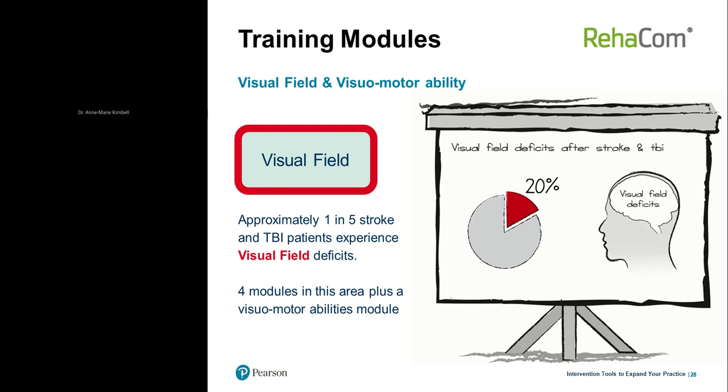There's a substantial amount of evidence that patients can be supported to compensate and adapt to visual field loss following stroke, using a range of strategies and methods. And so RehaCom provides systematic adaptive exploration exercises: saccadic eye movement, searching missing numbers, identifying shapes, searching and counting objects, reestablishing assigned perceptual functions by intensive light stimuli. They're also very complex. So some of these are valuable for patients with visual spatial neglect as well.